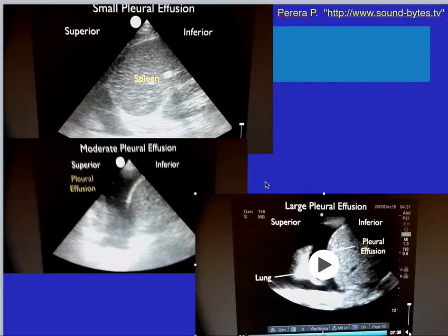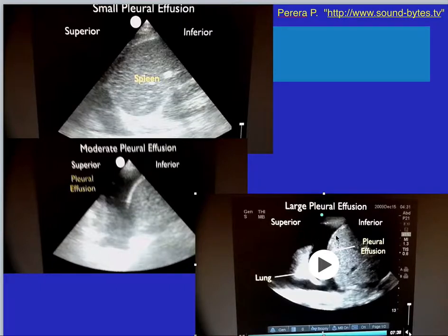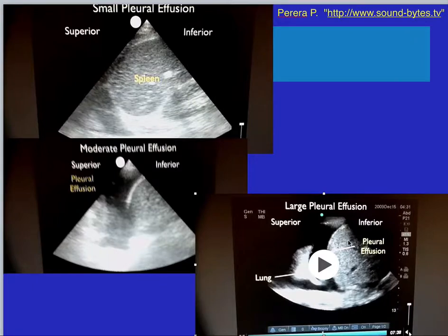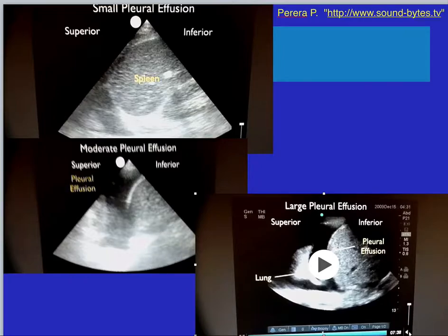One of the important things to remember: before evaluating the effusion, you must be able to identify the diaphragm and the chest and lung cavity. The way you do that is by showing the kidney-liver or kidney-spleen interface, then the liver or spleen by itself, then the diaphragm. The diaphragm is the most important structure to identify when evaluating for pleural effusions.